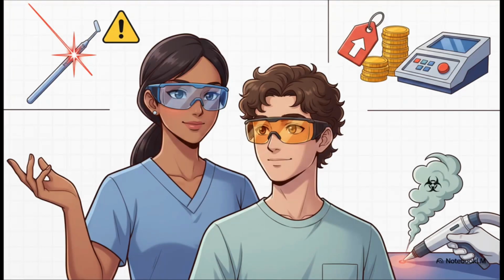And here's the fine print you have to know. First off, these machines are expensive. But more importantly, there are real safety issues. That perfectly straight beam can bounce off a shiny dental mirror and cause accidental damage to tissue you didn't mean to hit, or even worse, to someone's eyes. That is why everyone, the patient, the dentist, the assistant, anyone in the room has to be wearing special protective eyewear rated for that specific laser. And finally, when a laser vaporizes tissue, it creates this smoke, or plume, that can contain hazardous material. So you need high-speed suction right there to capture it.